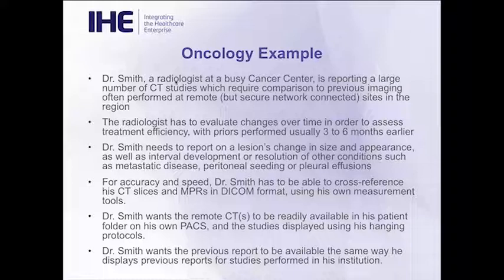So a lot of imaging is done in community hospitals, and then the patient would come for the consultation, have one CT done at the cancer center, or even the prior imaging is done in the community, the original imaging, and the radiologist will have to be able to compare the images for the oncologist. And very often there is not much time to do that, so it has to be quick and efficient.